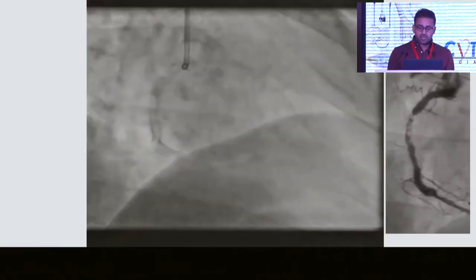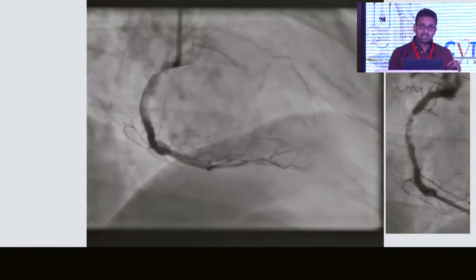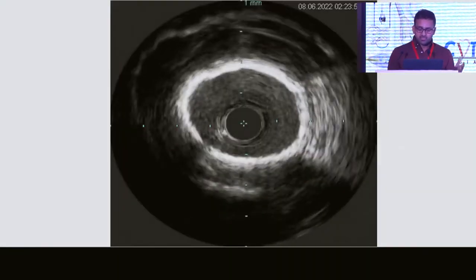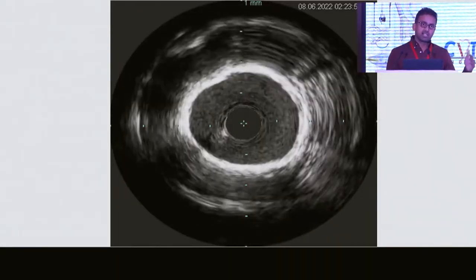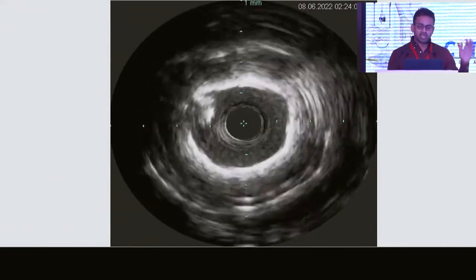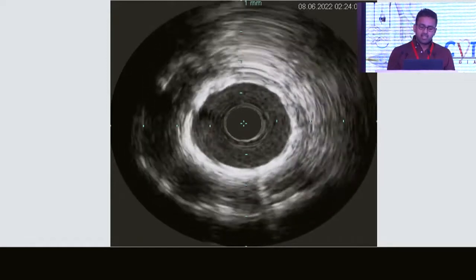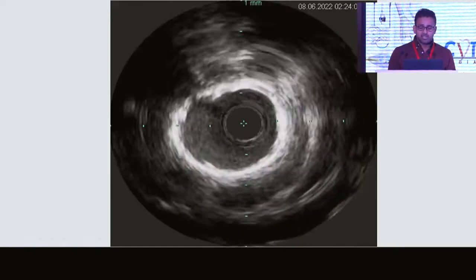On the right-hand side, you can see the previous image, and this is a coaxial view, achieving a very pleasing MSA with IVUS. Of course, I'll show the final IVUS, and the IVUS was clearly from calcium to calcium, but then the MSA was very good. We had pushed all the calcium out. There's a little bit of calcium protrusion there, and the MSA was pretty good, and I was pleased at that stage.